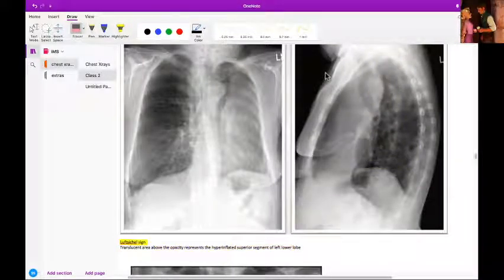Well, at least we're learning to spot something on the chest X-ray, if not anything else. I think I'll post them one sign a day, one by one, after the class. It's not even important, you just need to know.